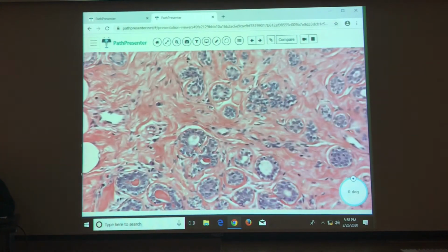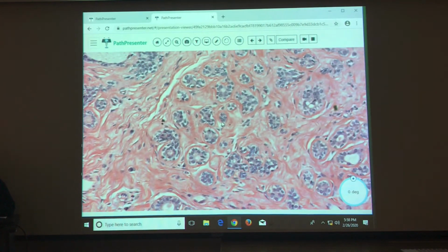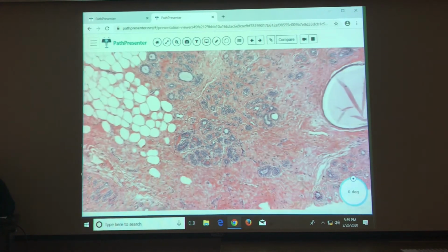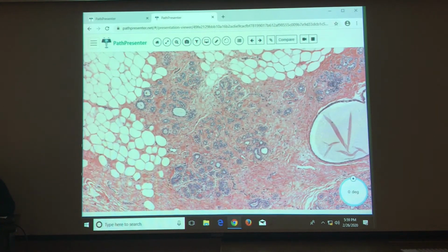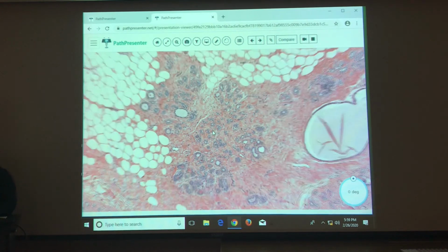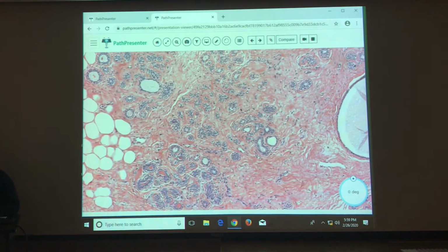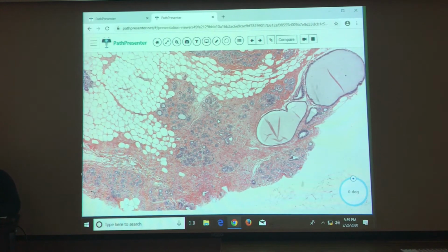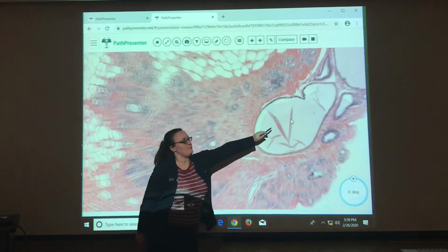So this can be microglandular adenosis or adenosis. We just see a lot of proliferation of the small glands, the ducts, and with the very fibrotic stroma, sclerosing adenosis could be one possibility. I mean, that could be artifact, but there could be some eosinophilic material in there.